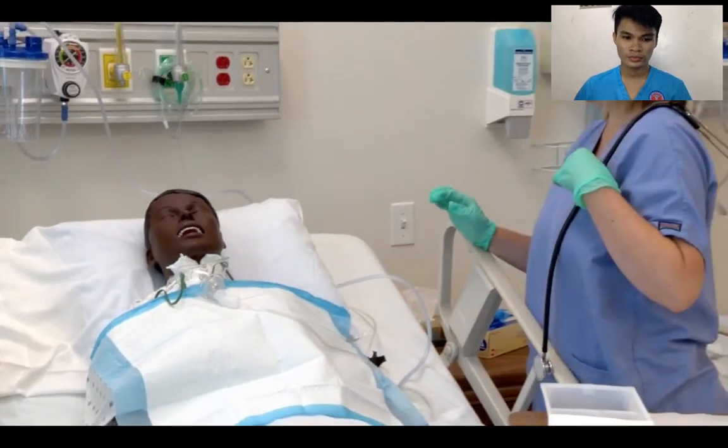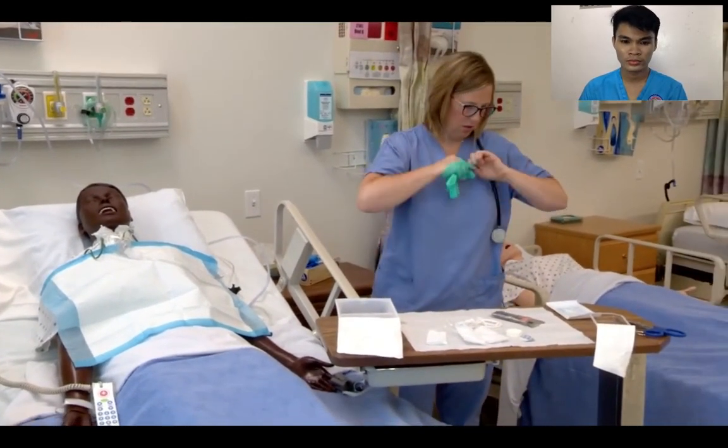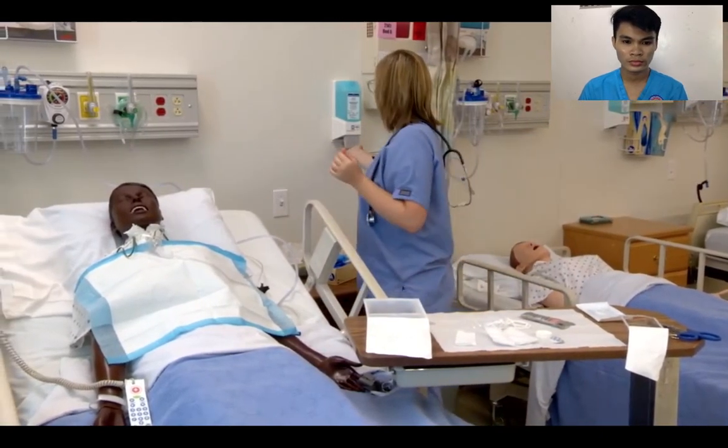Mr. Jones. Now I'm going to continue with my trach here. We're just going to clean up around the side a little bit and change your gauze.